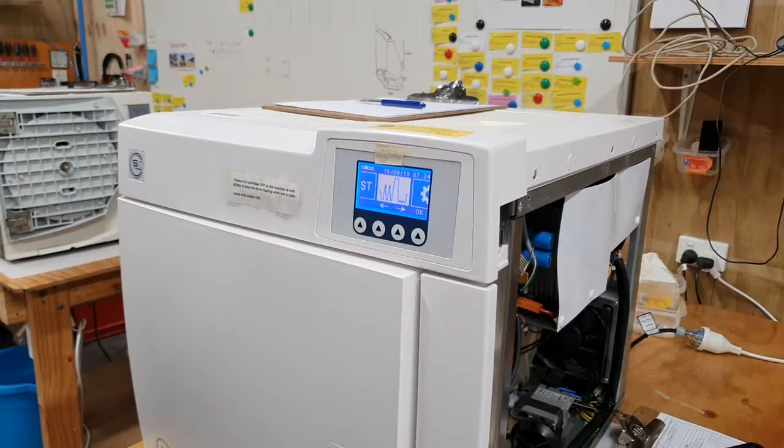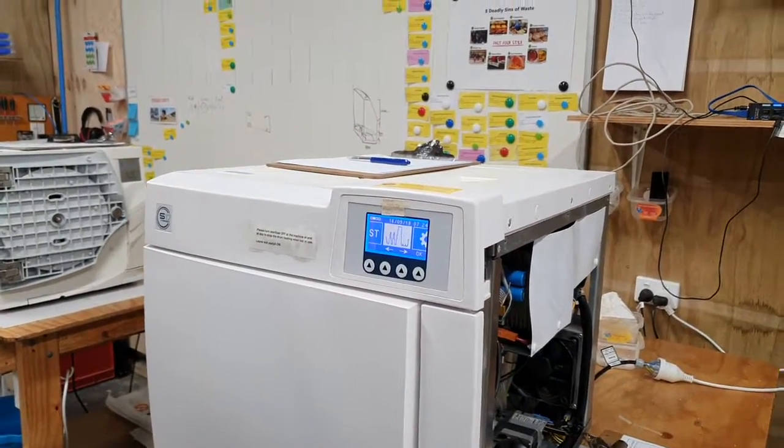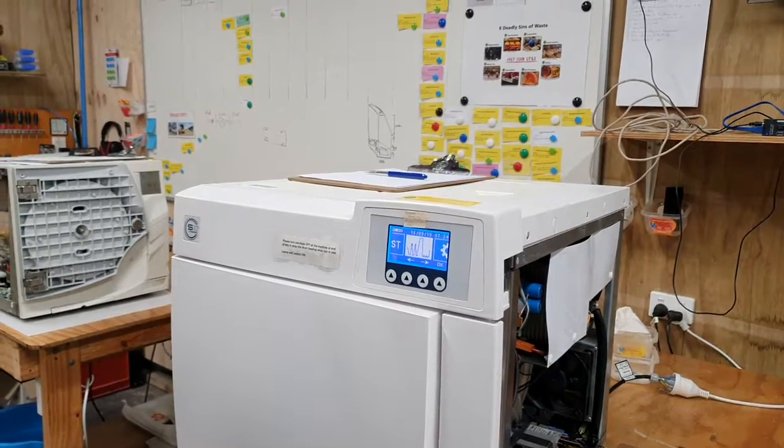So on these machines, we don't leave the key in. We only put the key in to download the cycles. Otherwise, it can cause some errors. Yes. Okay, thank you.